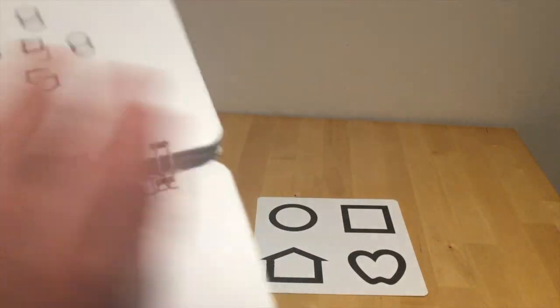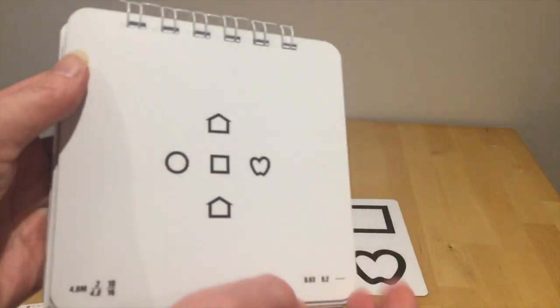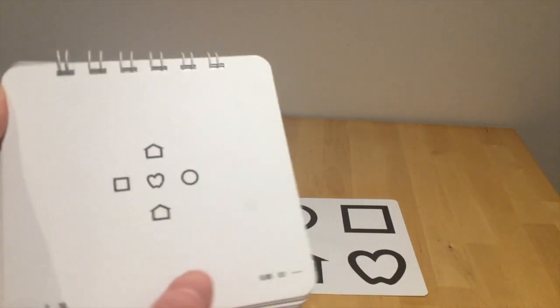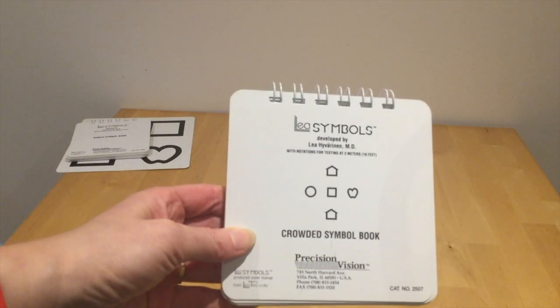And once you get to the end, if you haven't made a mistake, it flips over to the other side. So 3 over 4.8. You need to have fairly good acuity for that as well. So that is the Crowded Symbol Book.